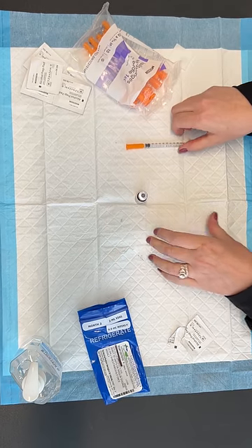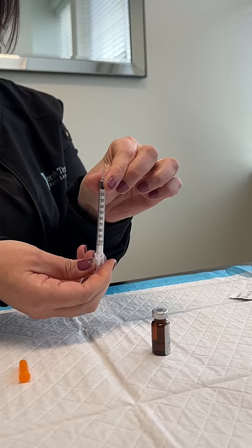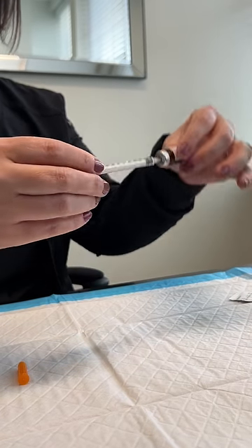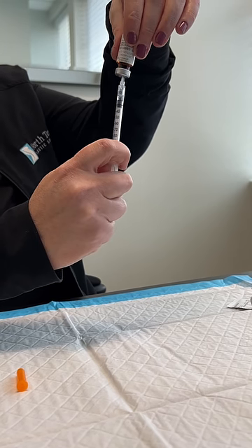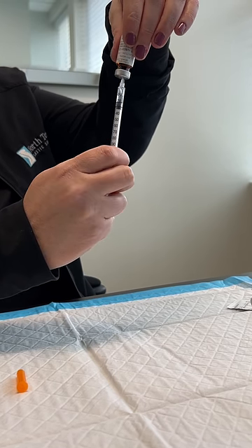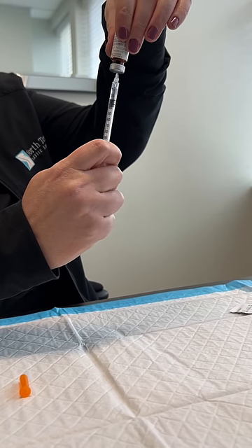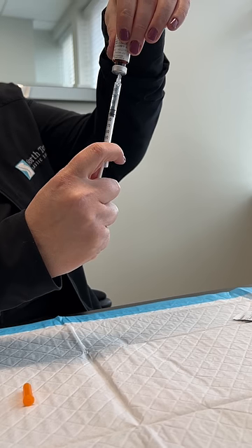Now it's time to inject the medication. Take the cap off the needle, stick the needle into the port of the vial, and then invert the vial so you can get the medication more easily. This medication is quite thick, so be patient when pulling it up. I usually pull it up a little bit past the dosage and then push the medication back into the vial to eliminate any air bubbles in the syringe.